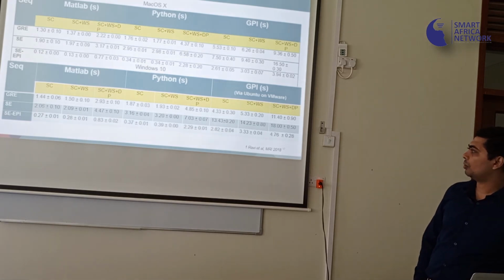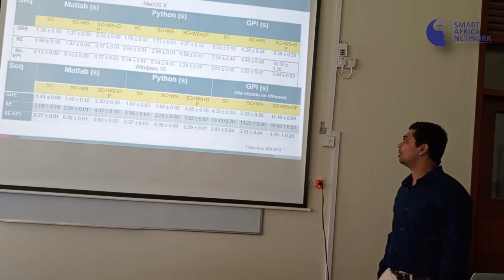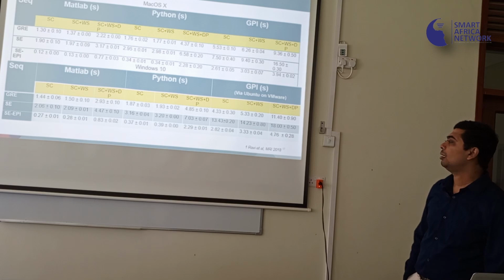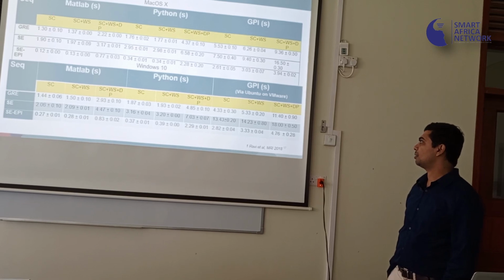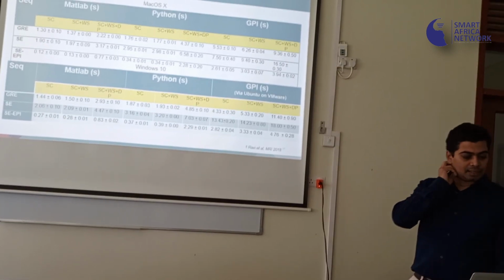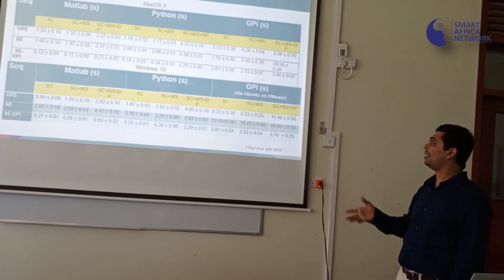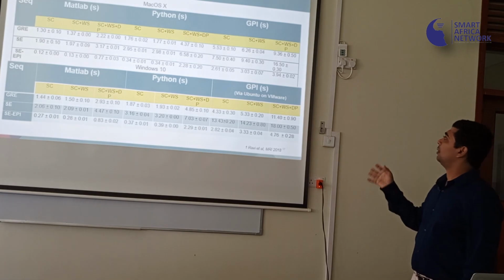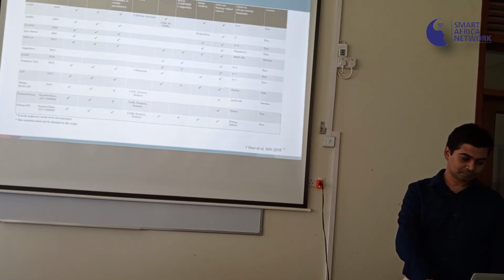I'm happy to go into the details, but there are 3 different ways. One looking at white matter, the other one looking, probably more interestingly, at gray matter and certain hyperintensities in white matter, and then the last one is super rapid scanning. We benchmarked that with vendors using MATLAB, Python, and this graphical programming interface on 2 operating systems.